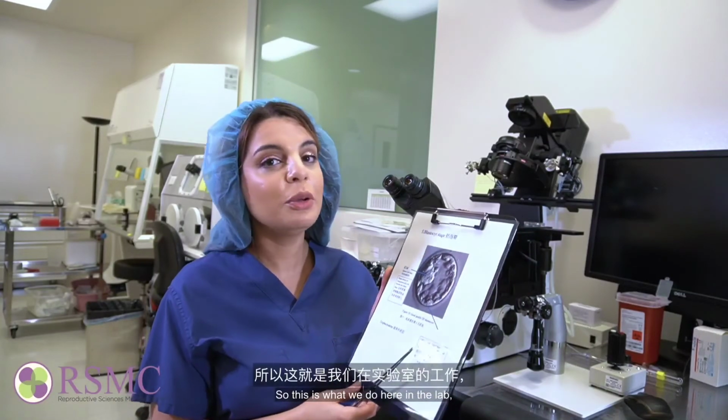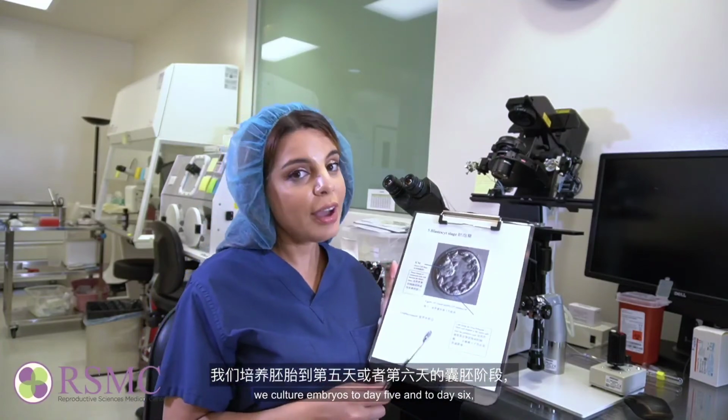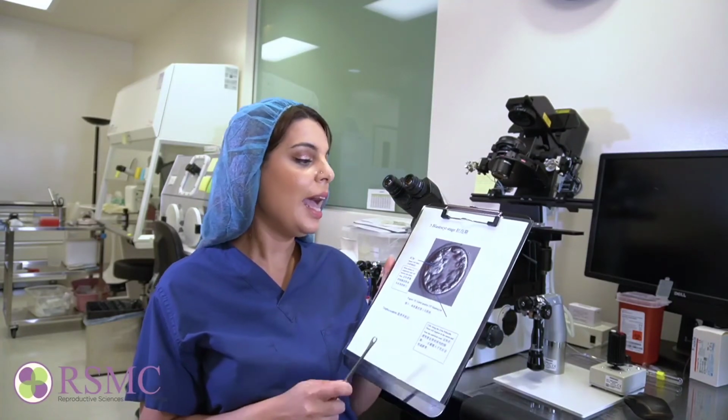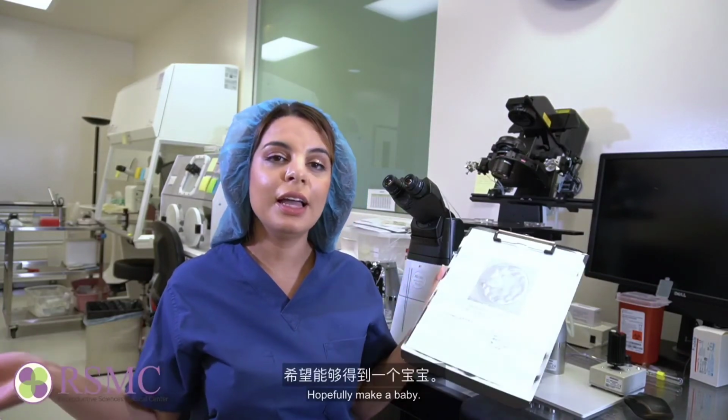So this is what we do here in the lab. We culture the embryos to day 5 and day 6, and then we are ready to transfer them into the uterus and hopefully make a baby.